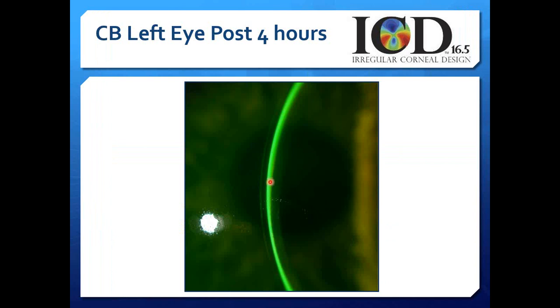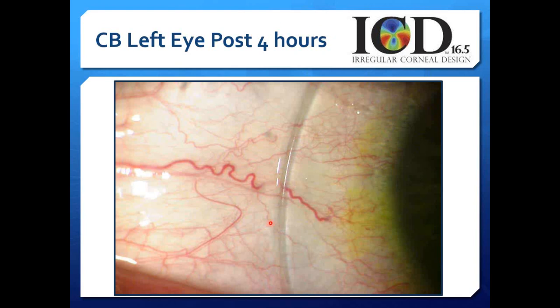When we pull up the optic section, it looks like there might be 200 microns of fluid, although the OCT showed maybe 100, but definitely we're seeing less fluid here. This might be in the 100 micron range. So compare the anterior surface fluid versus your 300 microns of lens, and that will tell you how much posterior surface fluid you have. Then check your edge. Make sure that you're not seeing any sealing off of these vessels.